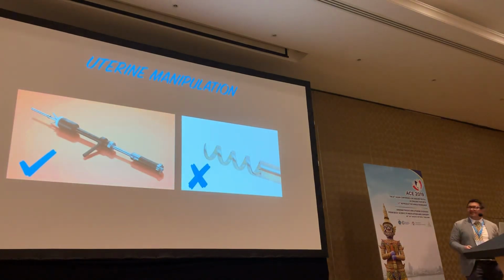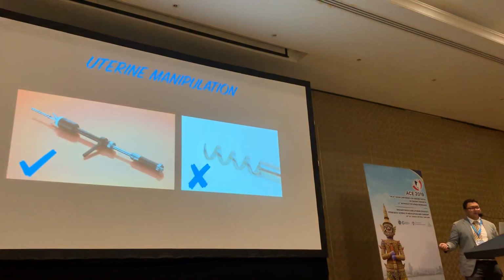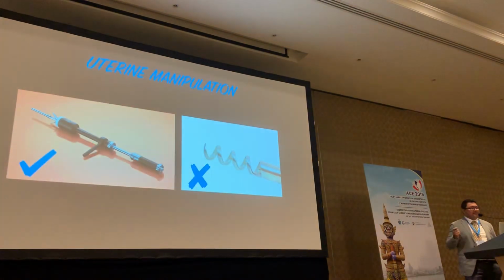Coming to uterine manipulation. This is not a uterine manipulator, this is a myoma screw. It's for screwing into a fibroid. A lot of people in my country use this because they don't like to use a vaginal assistant. We have 1.6 billion people and growing. We have no shortage of people in the OR, okay, when we operate. And I need my assistant to assist me, not just hold the camera. My assistant is a very accomplished surgeon in most cases, so I have no complaints there, right?